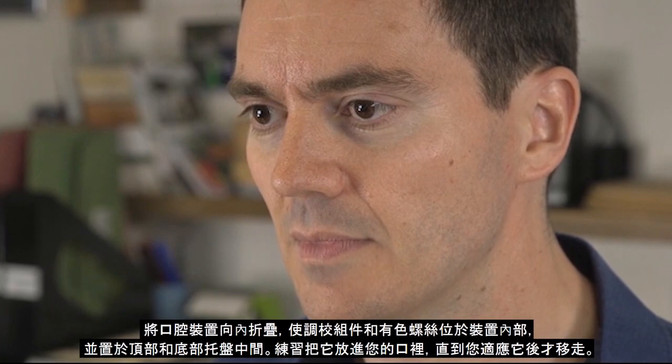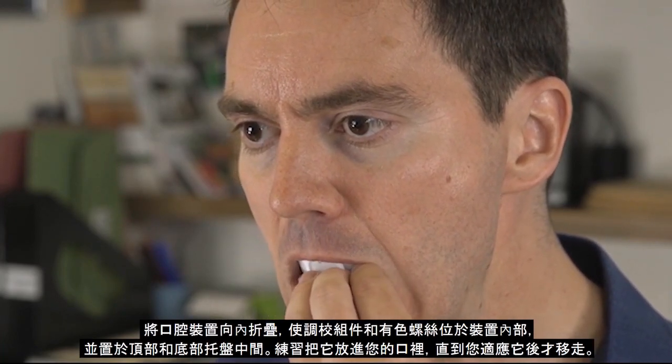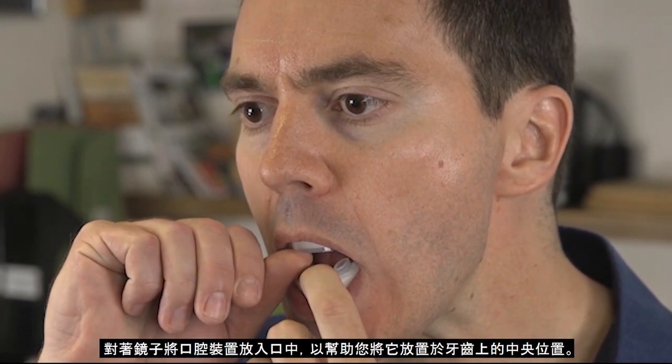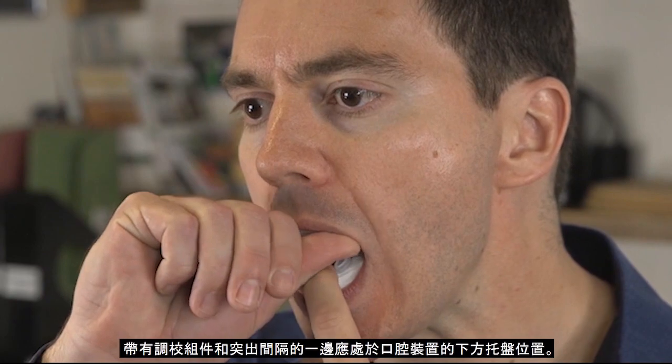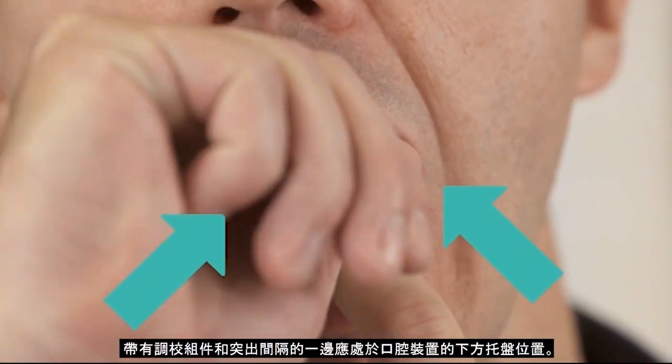Make sure you have the Oral Device the right way up. Practice putting it in your mouth and removing it until you are used to it. You can look in a mirror to help you place the Oral Device centrally on your teeth. The bottom tray of the Oral Device is the one with the adjustment blocks and spacers on.